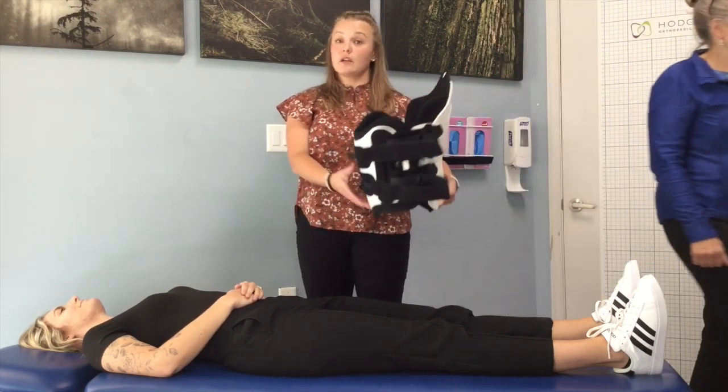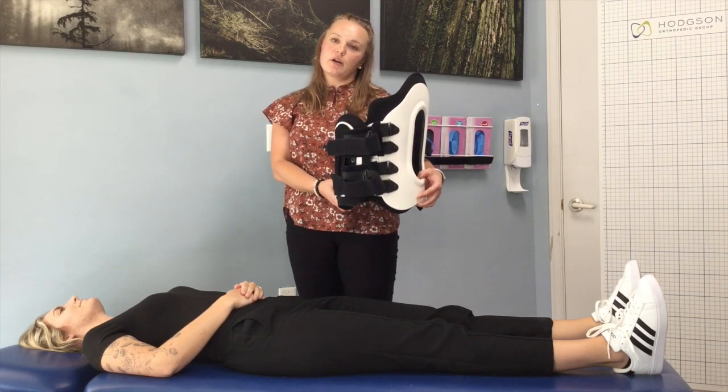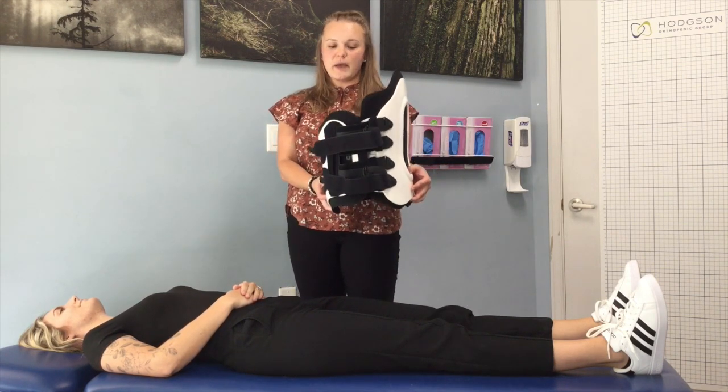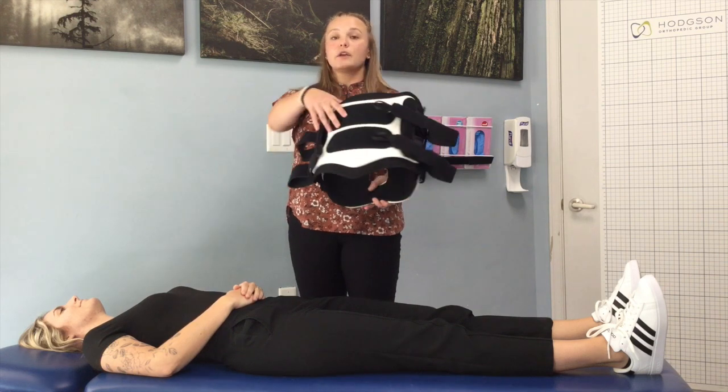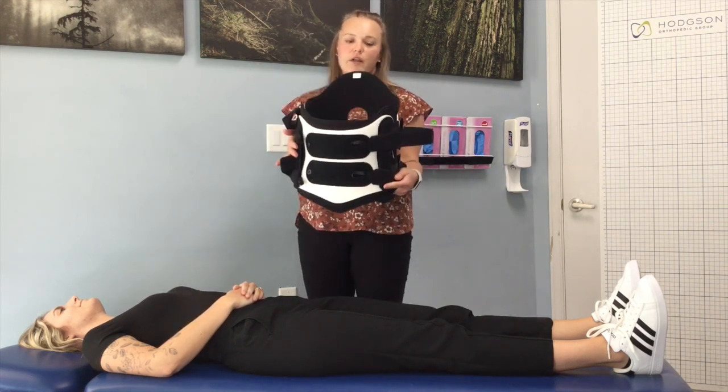This one specifically is called the Edge brace. This brace is going to be for any injuries, traumatic or non, of the lumbar or sacral spine. The brace is made out of two portions — a front piece and a back piece — and it's secured with Velcro closures.